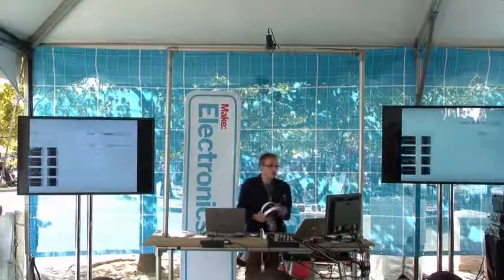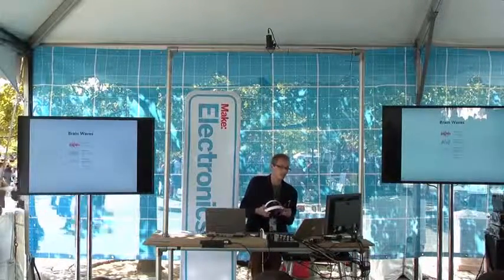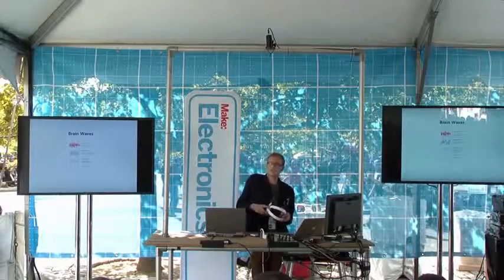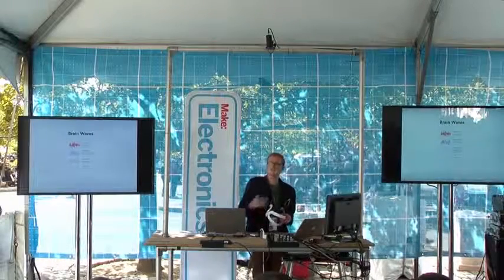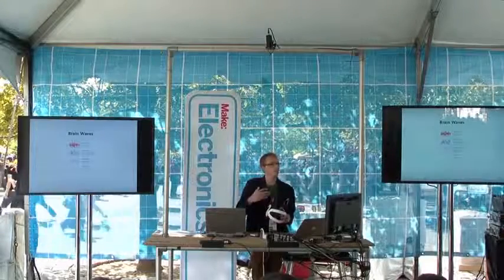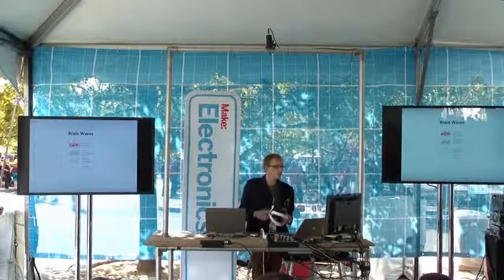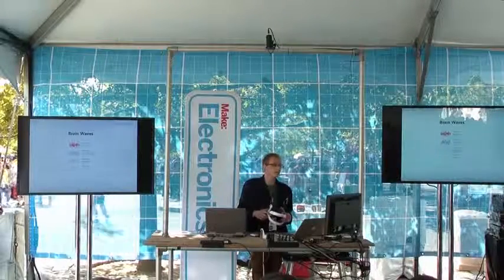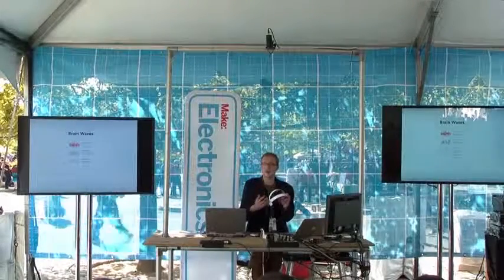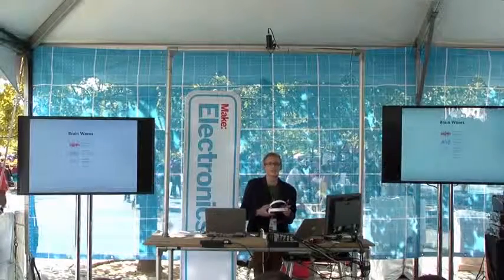The brainwaves that can be recorded by an EEG set are in the first place alpha waves, which are an indication of relaxation. You can induce that by closing your eyes, and we started from that for our game also. The idea is that the player tries to relax to achieve the goal of the game. Other brainwaves are beta, theta, and delta, which we don't read. It has the capacity to read these because it gets a raw signal, which has to be filtered, of course. We only filter for the alpha waves.